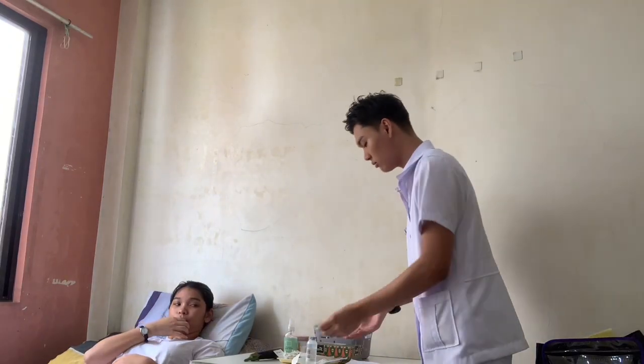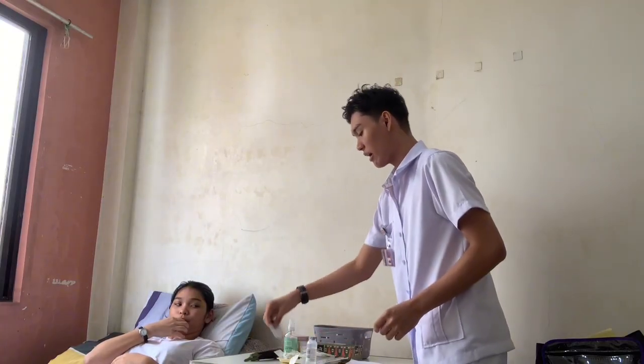And I'm going to connect. Now, ensure that the connection isn't loose. Set it down. And I have here an alcohol pad, or you can use a cotton ball soaked with alcohol.